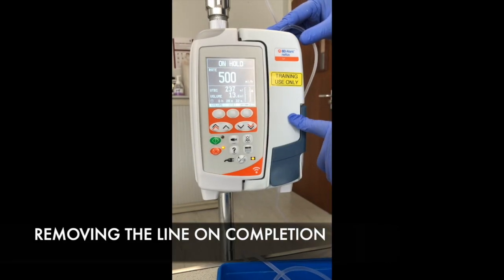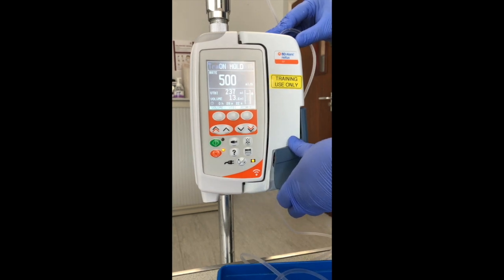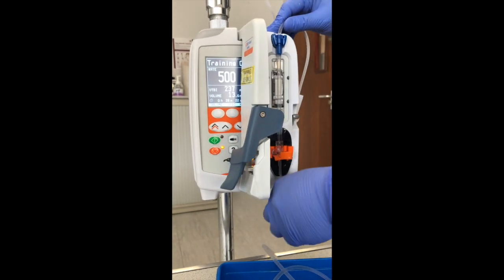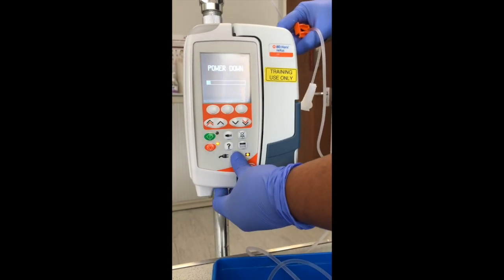Once your fluid is finished or the therapy is finished, you can stop the pump and remove your administration line, close it, and press and hold the power down button.